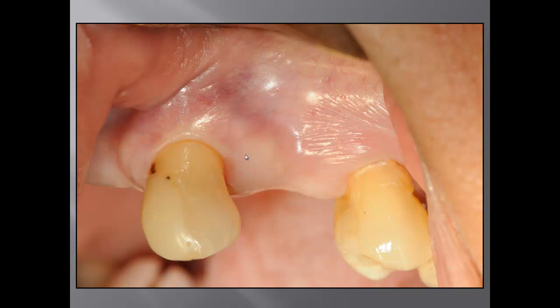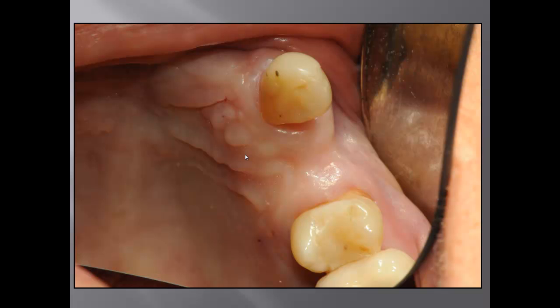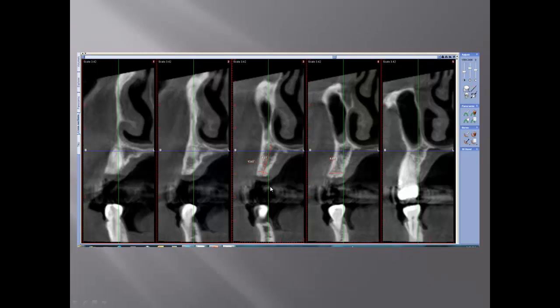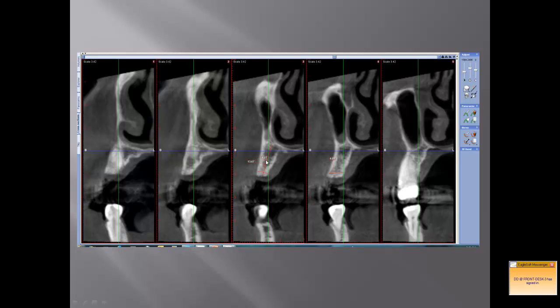This is a close-up view showing she has a buccal concavity, which I must keep in mind when placing the implant and planning how much bone we have. On the 3D picture you can see we have almost 13 millimeters in height but only about 4 millimeters in width. We don't have enough bone in width, so I already know ahead of the surgery that I will need a bone graft around the buccal area.